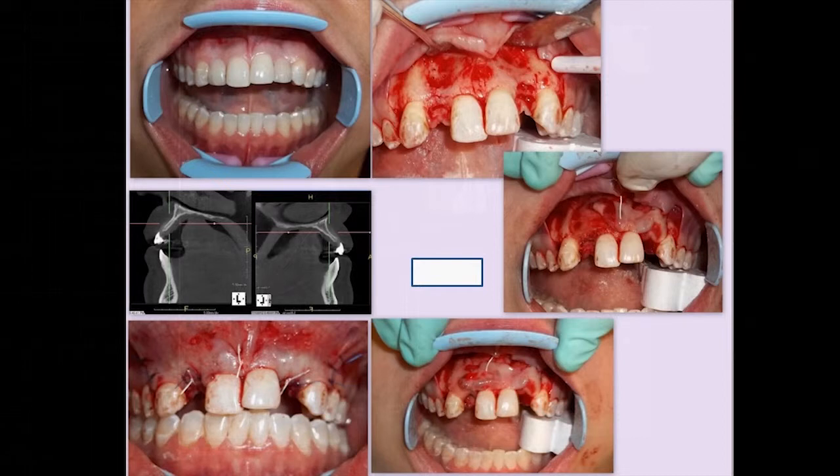And so you have to look real hard here, but what you see here is, here's after the area is flapped up. You can see the invagination up in these areas above 7 and 10. Here we've got our graft material placed with the sonic weld. You can't see it because the membranes are clear. It's like a clear acetate. And what it does is it stays stiff, so it prevents the lip pressure from causing that bone graft to resorb over time.